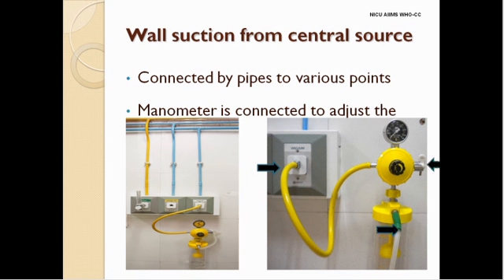There is a separate on and off switch. It does not require any electricity but requires a constant suction source for working. The main disadvantage is its high cost, otherwise it is very easy to use.